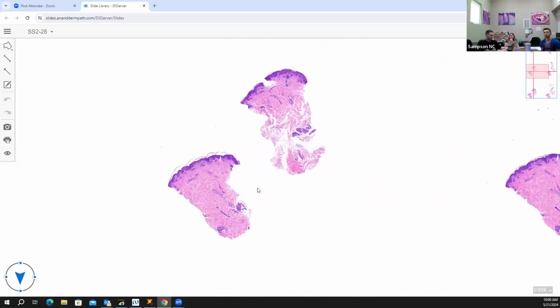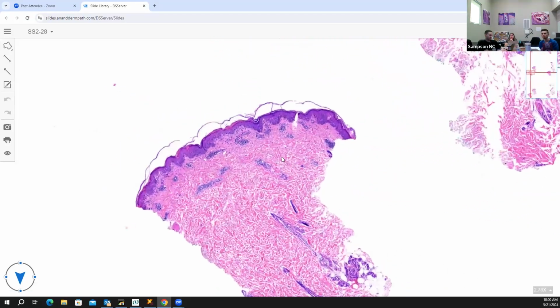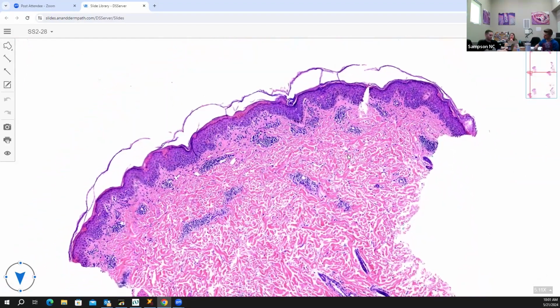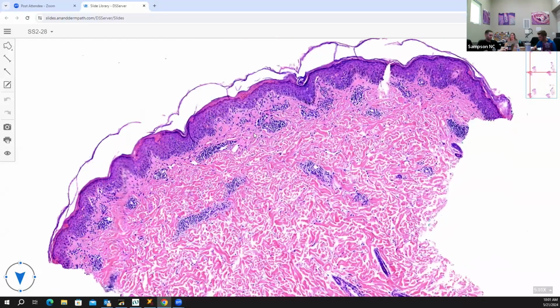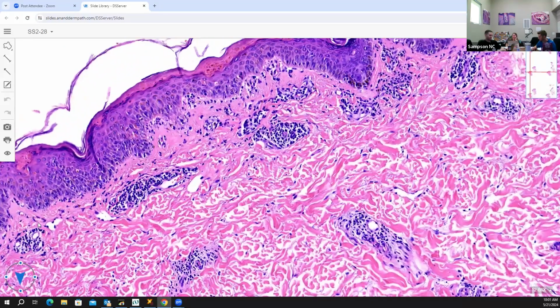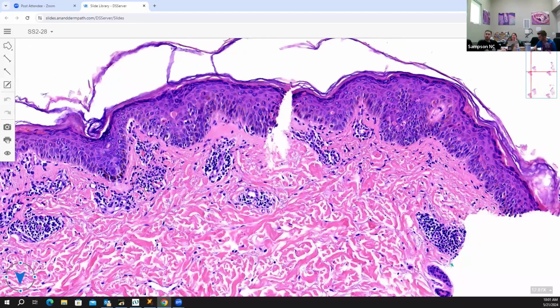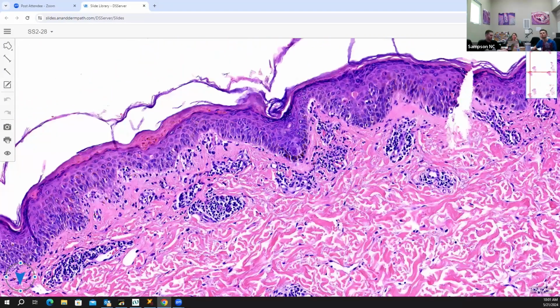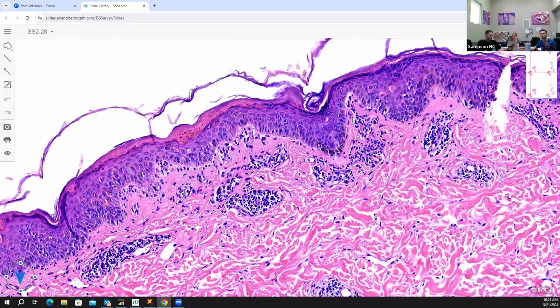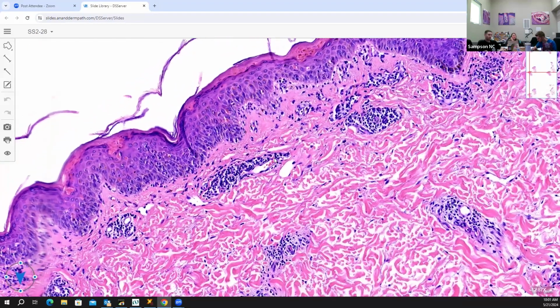We got a punch biopsy. It looks like there is a sparse superficial and deep infiltrate in this punch biopsy. From afar, some of the cells are at the DEJ right here, some sort of interface process. It's leaning more towards a connective tissue process, I think. Acute or chronic? Chronic. It looks more thinned out, and it's not super inflammatory, so it's more of a chronic process.